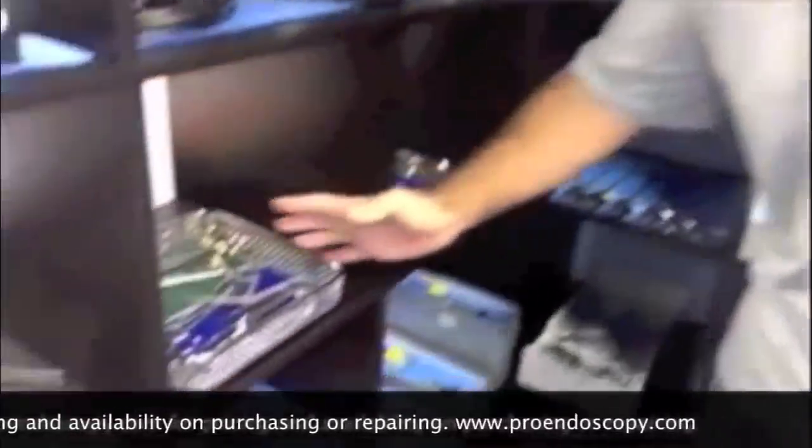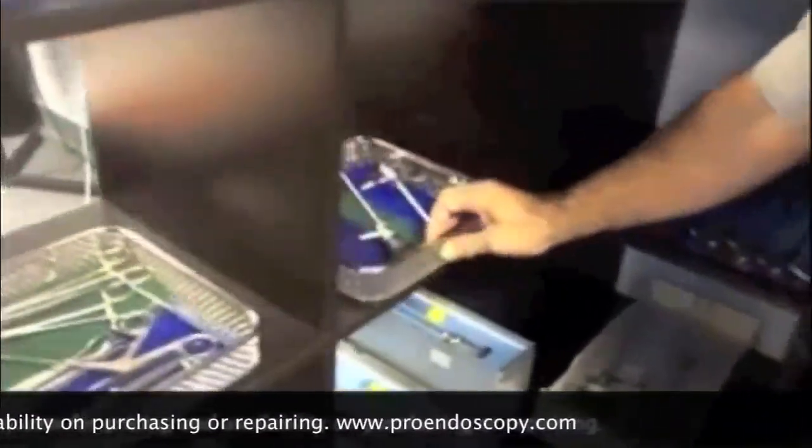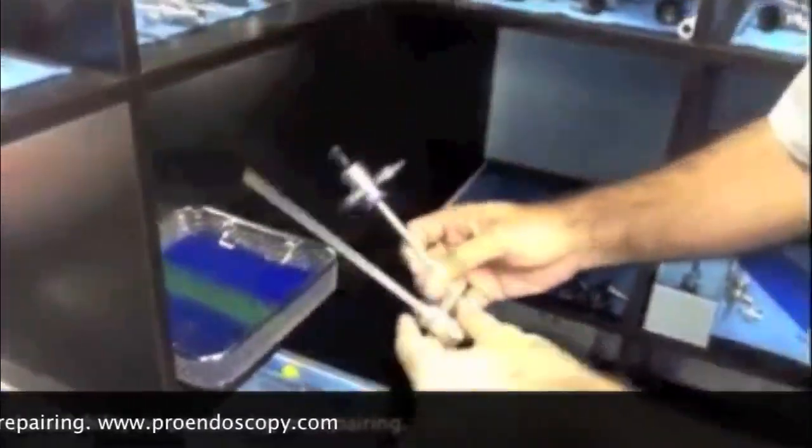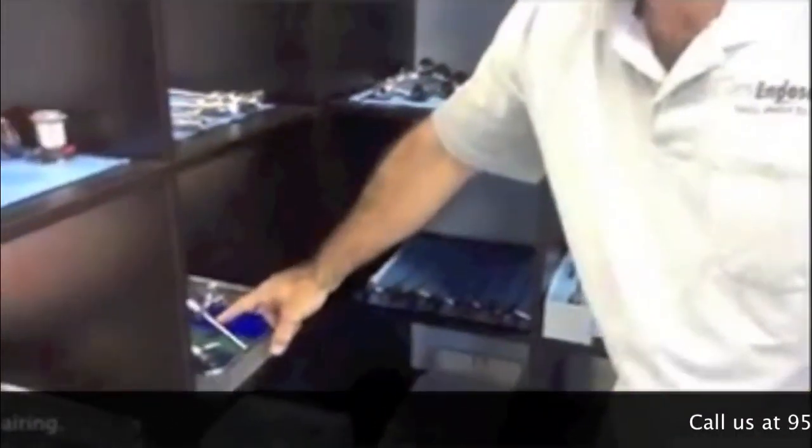Here we have a little tray. Here we have an arthroscope, the complete set, with the trocar sheath. Very nice set. Then we have a different diameter — this is a 4mm, 30-degree set that we have.